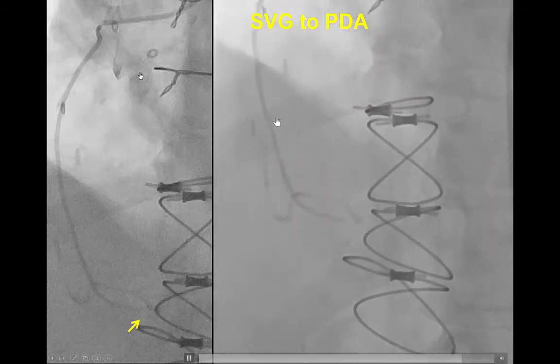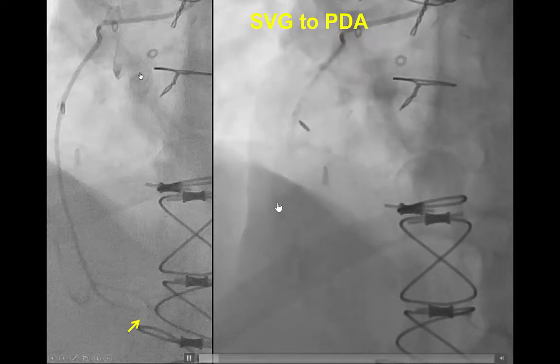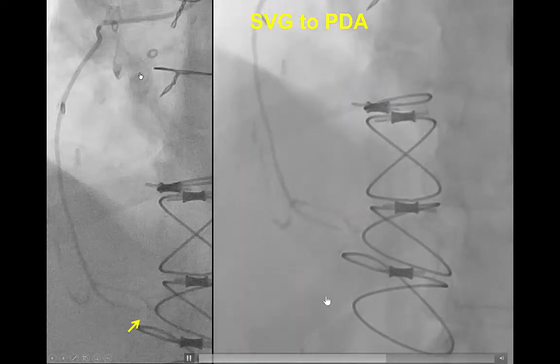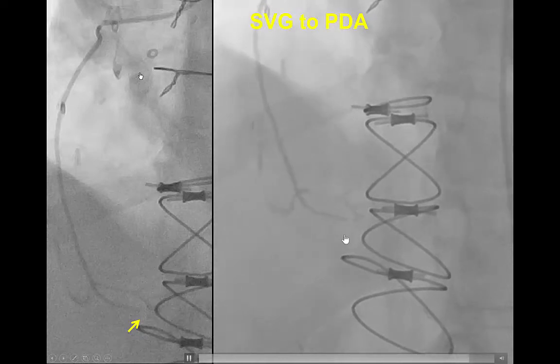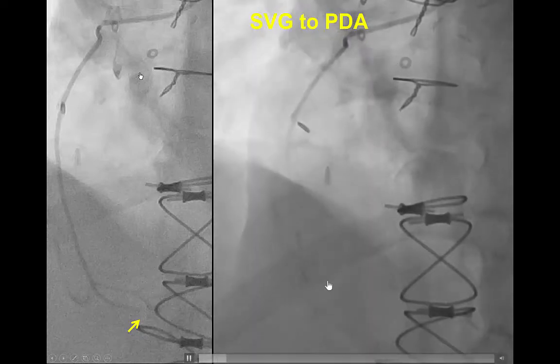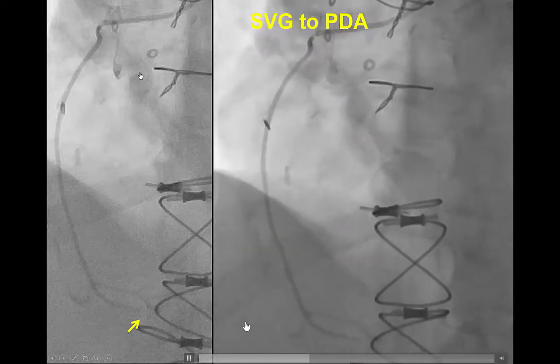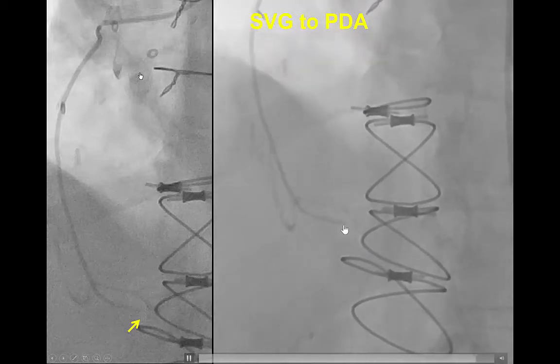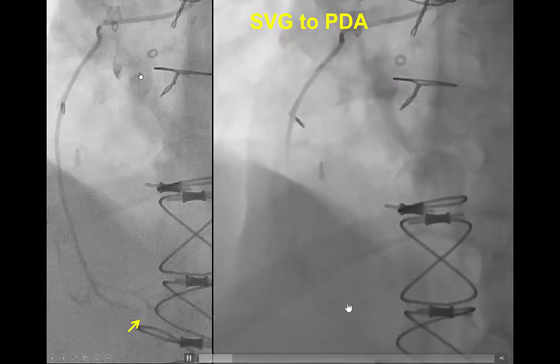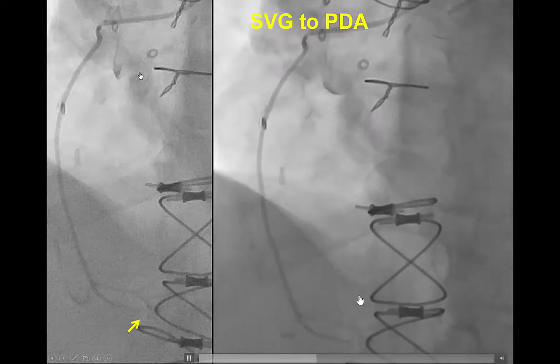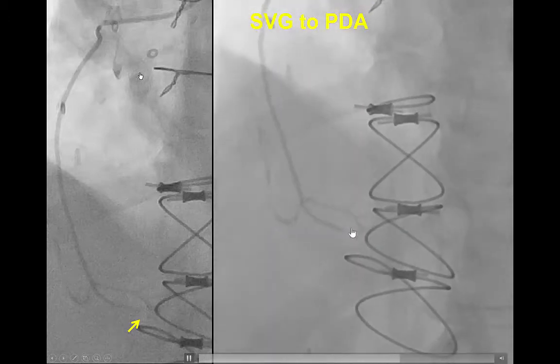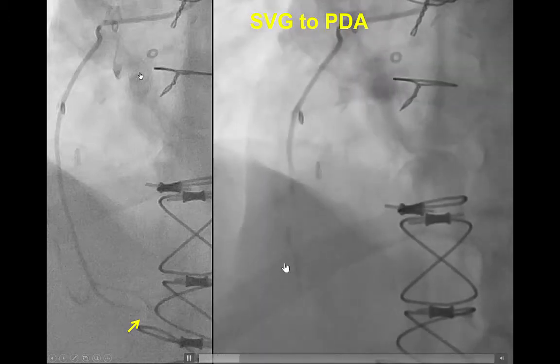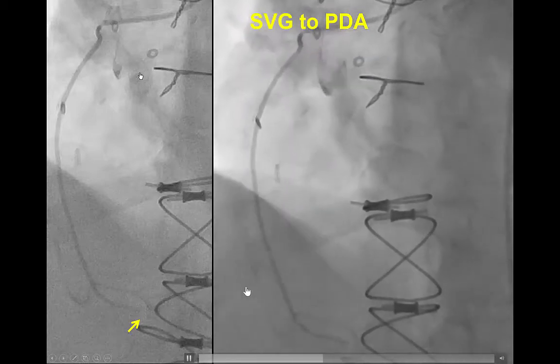We had a blunt proximal cap, approximately 40-50 mm occlusion length, good quality distal vessel, and a vein graft supplying the PDA. The patient was referred for PCI of the native right coronary artery because the risk of both acute and chronic complications by intervening on the anastomosis of the vein graft was considered to be greater than recanalizing the native right coronary.